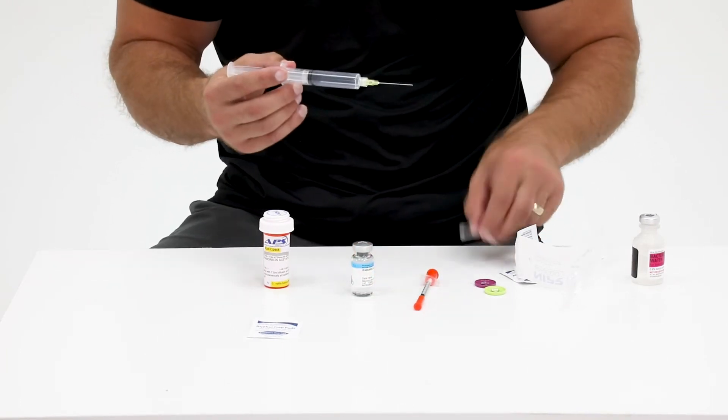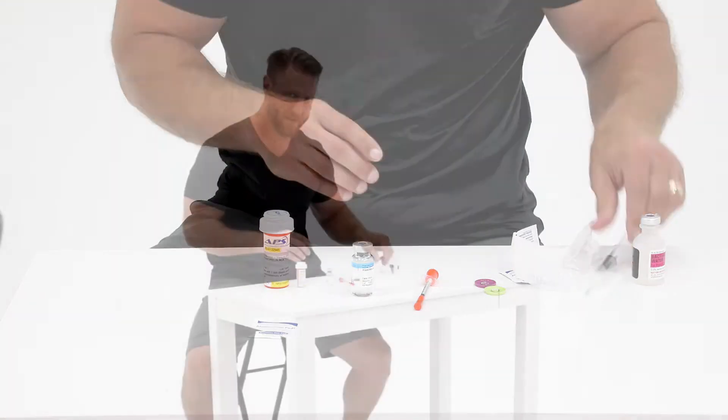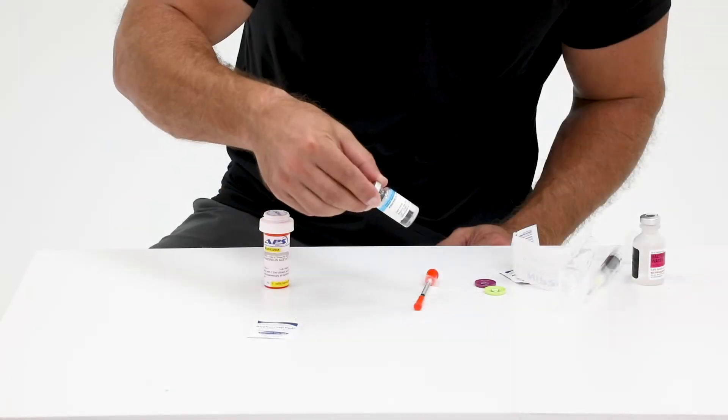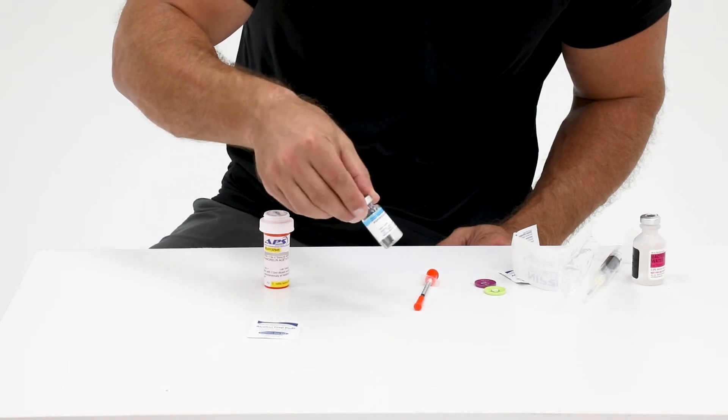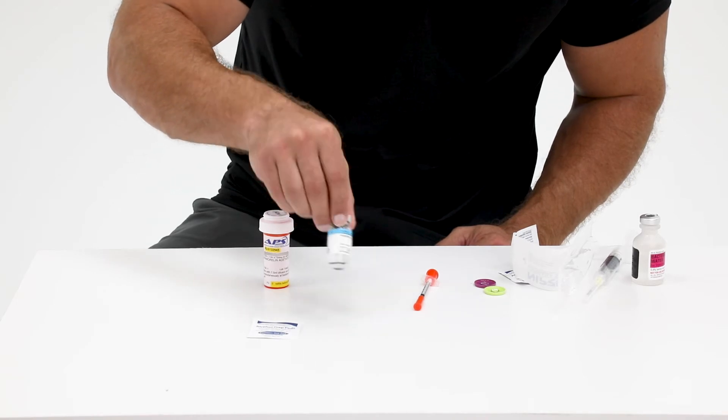Place the cap back onto the syringe and discard the needle. Lastly, gently swirl the vial of bacteriostatic water and lyophilized powder until all of the powder has been dissolved into the solution.